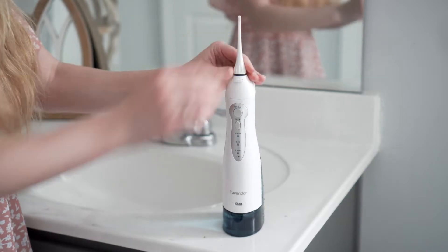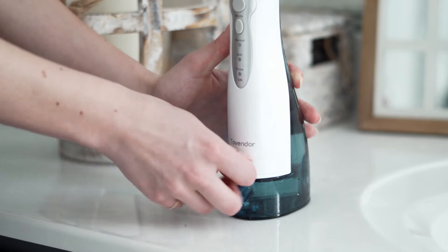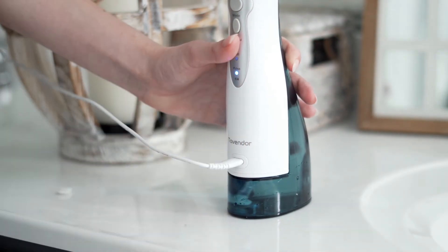Finally, there's a pulse mode which you can use to massage your gums. To start using it, just charge it up using the included cable with any charging cube you like. What I love about this is you can charge it for four hours and then use it for an entire month before charging it again.